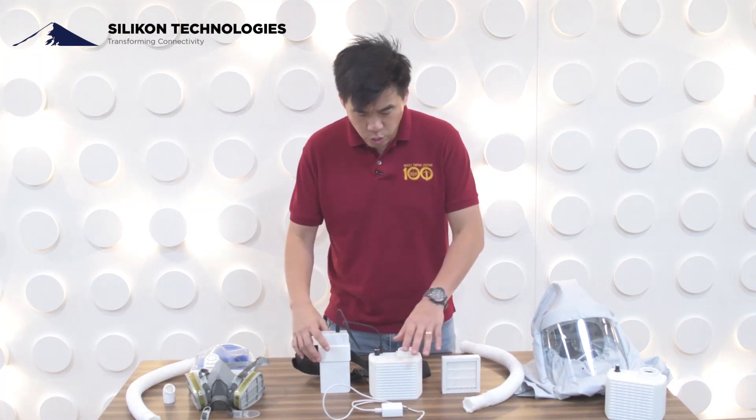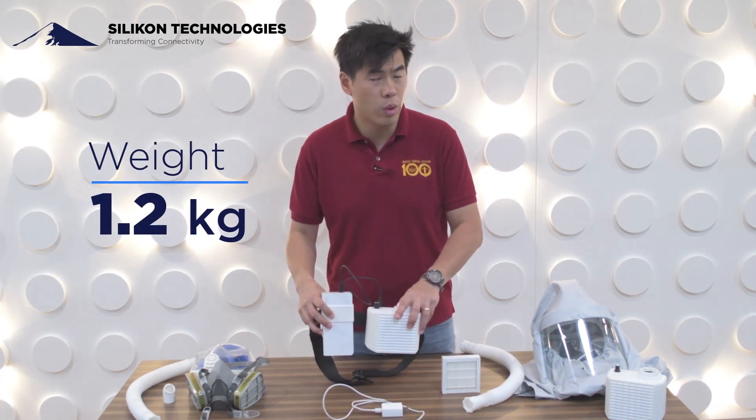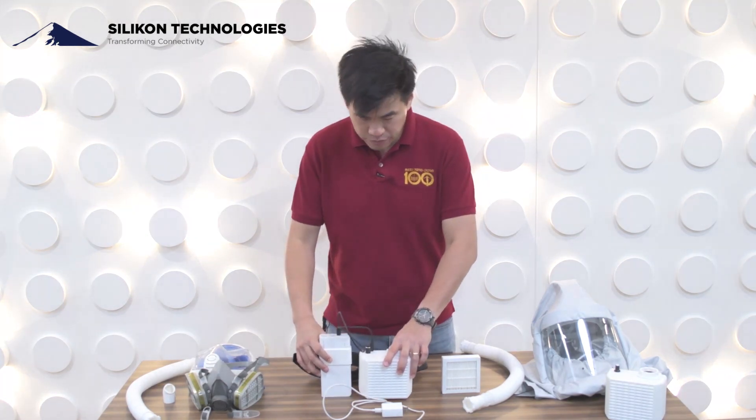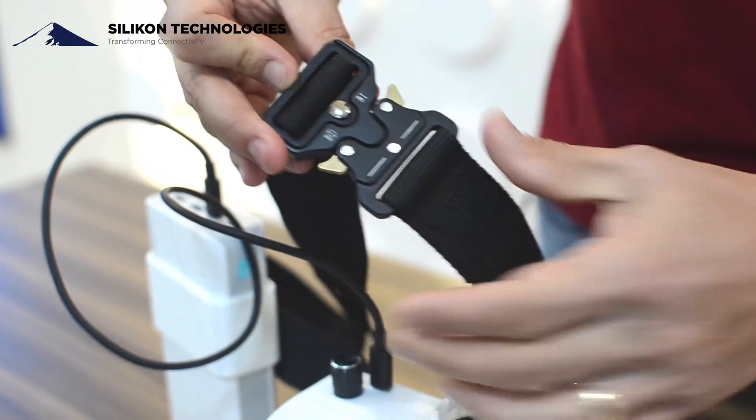In terms of weight, the weight of this entire unit including the power pack is a little over one kilogram, so it's pretty light relatively. And you also have a quick-release buckle that is included in our package.